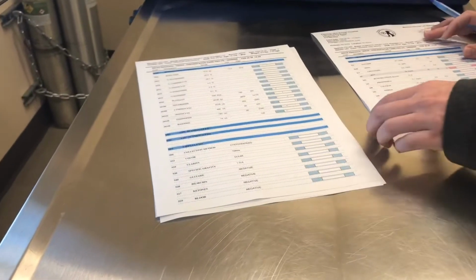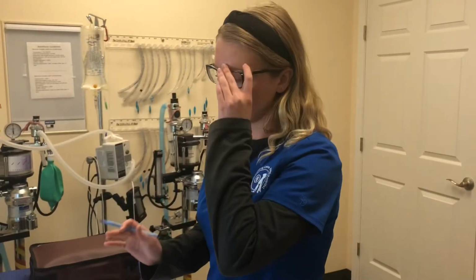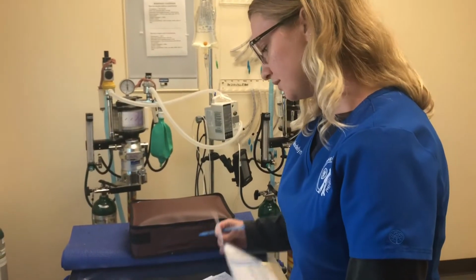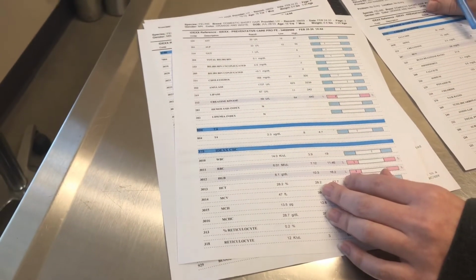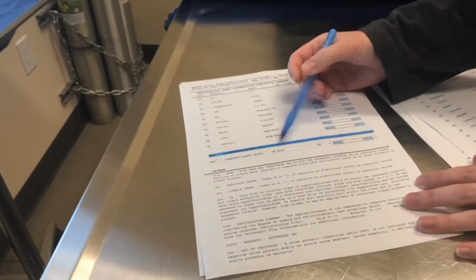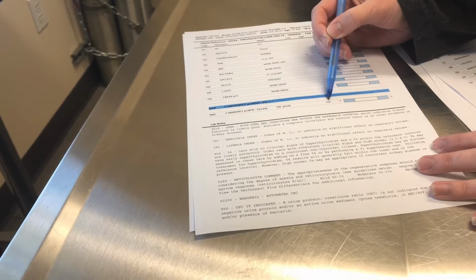At our clinic, we also require, as minimum databases for any anesthesia workup, a T4, which is a thyroid value. An example of a T4 here, this is within normal range. We also require heartworm tests, fecal tests, and cardiac proBNP values, such as this one. So 109 is higher than 100, but this is the normal reference range.